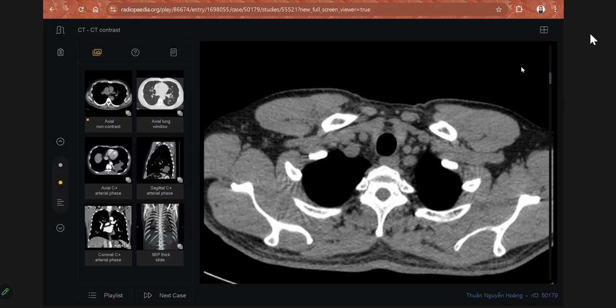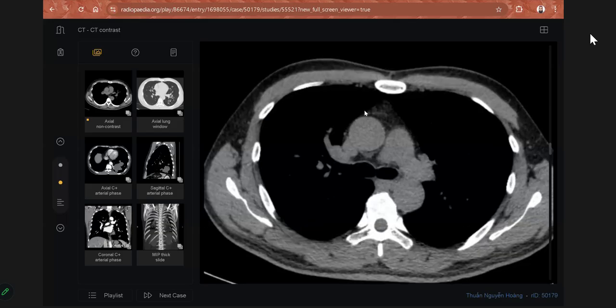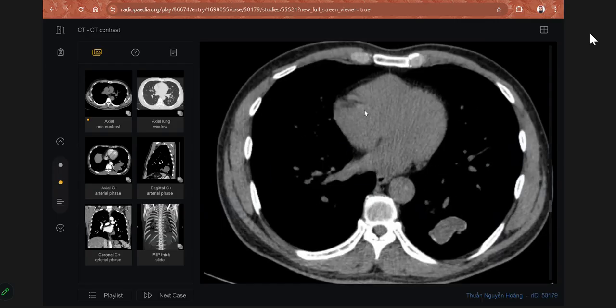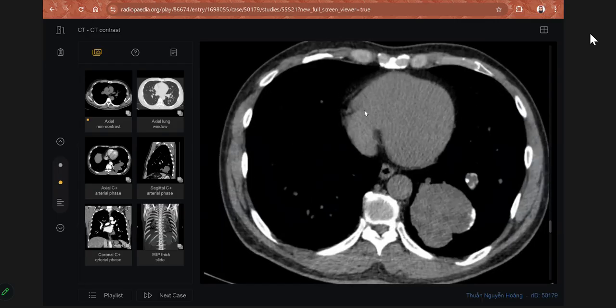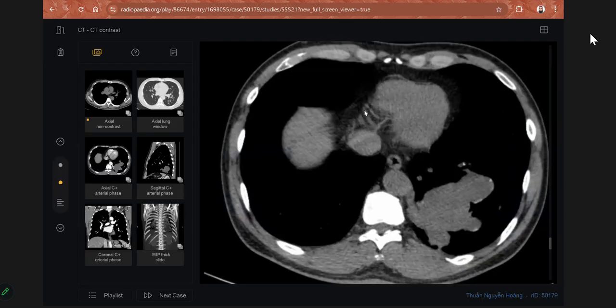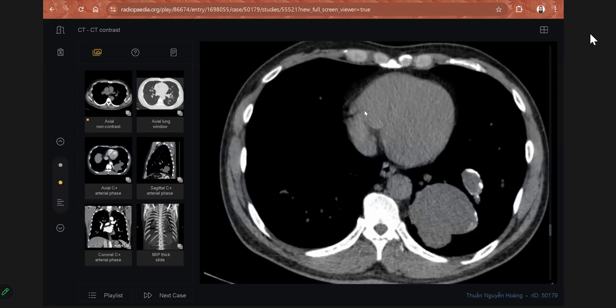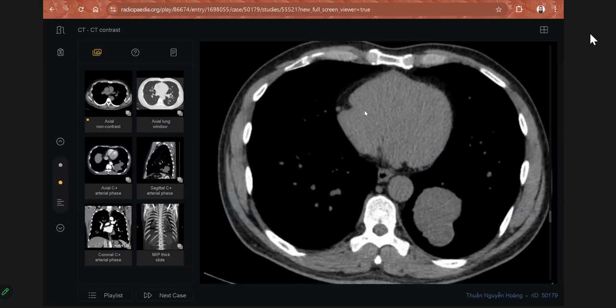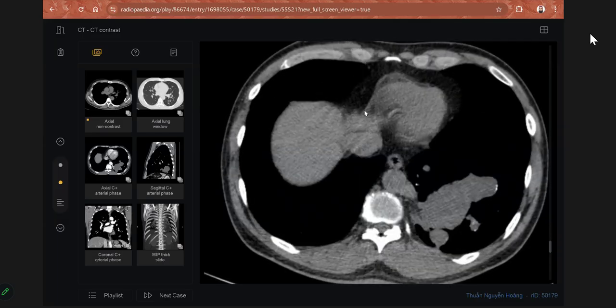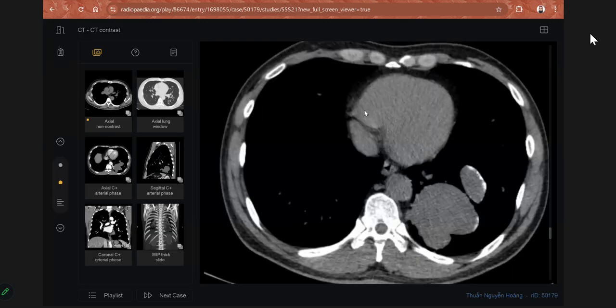So I'm provided with a non-contrast CT scan of the patient. I'm moving to my region of interest first, then I'll have a look at the rest of the scan. I could appreciate that there is a lobulated soft tissue density located in the posterior mediastinum. I could see a prominent vessel arising from the aorta and supplying it. In addition, it has significant lobulated margins, and a few calcifications are also seen within this mass.